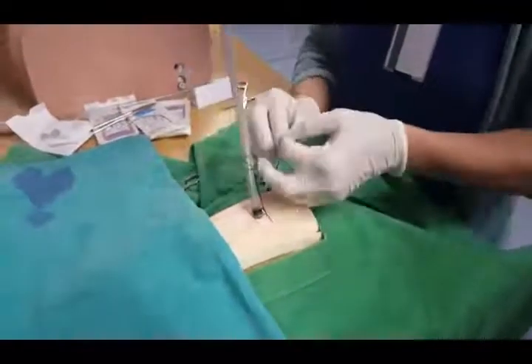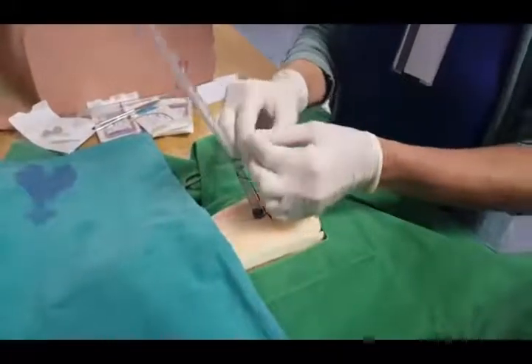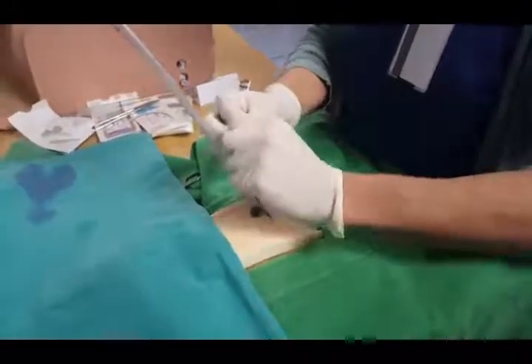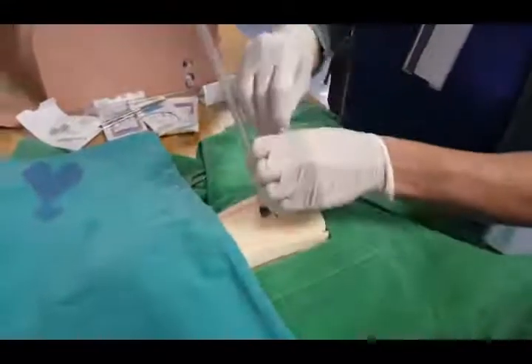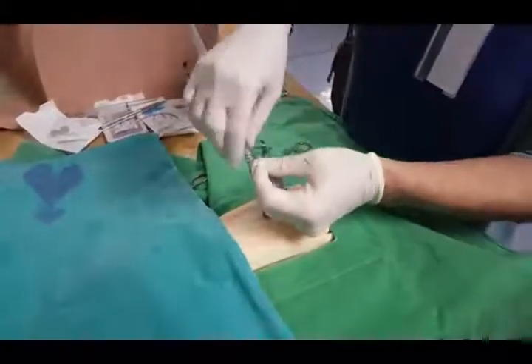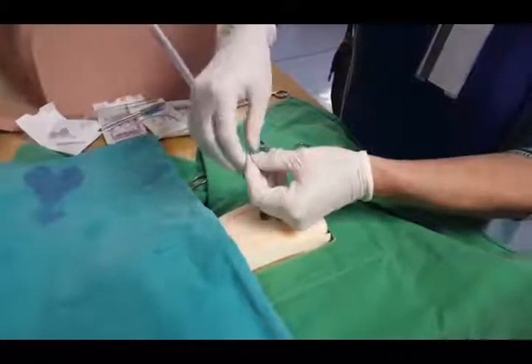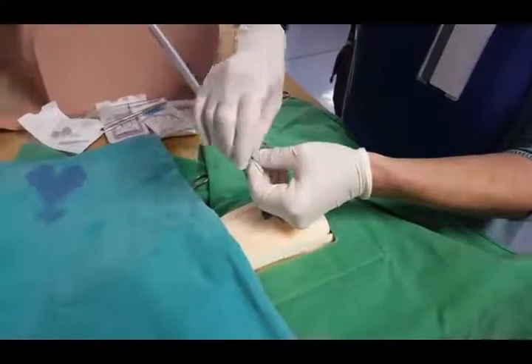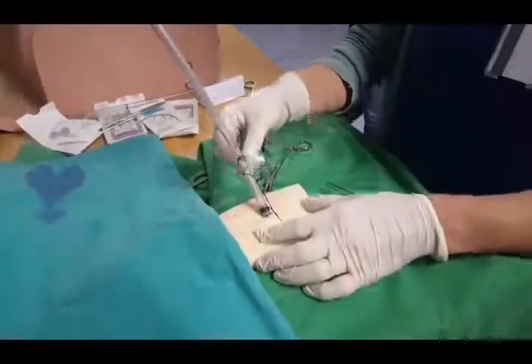Then you basically just wrap it around and tie it off in a simple knot with the top there. That's basically the gist of it. And there you can see it's nicely anchored in.